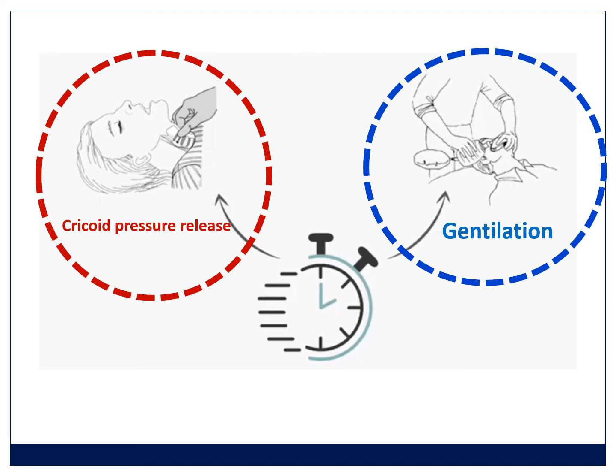Now that does a number of things. It firstly continues to oxygenate a patient who's prone to rapid desaturation, so your patient's less likely to desaturate. It reassures you that you can mask ventilate the patient, and it provides apneic insufflation even if you can't get air into those lungs.